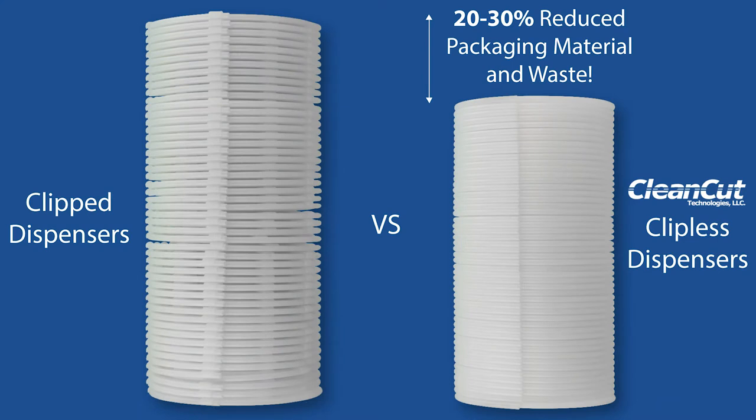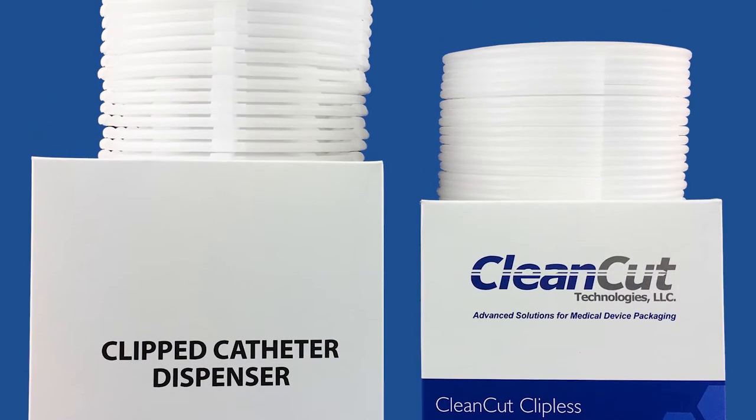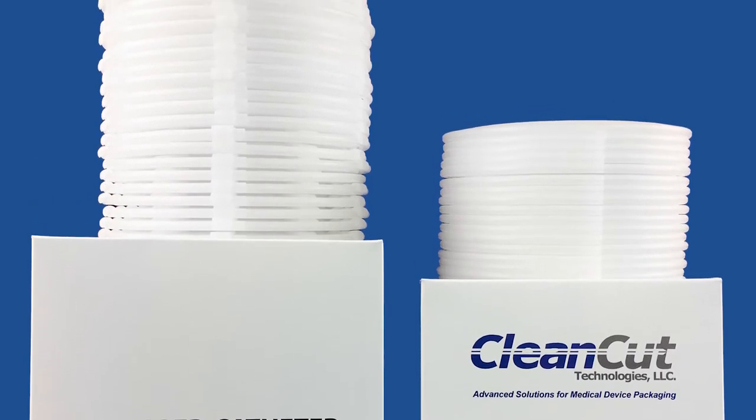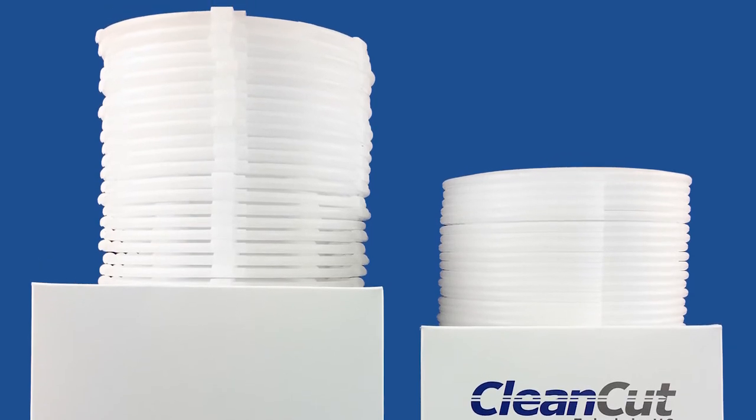In a side-by-side comparison of 50 clipped hoops and 50 of Clean Cut's clipless dispensers — both manufactured from the same size tubing — these reductions were clear. A smaller catheter dispenser size results in smaller pouches, shelf cartons, and shipping cartons, representing a significant cost savings for medical device manufacturers.